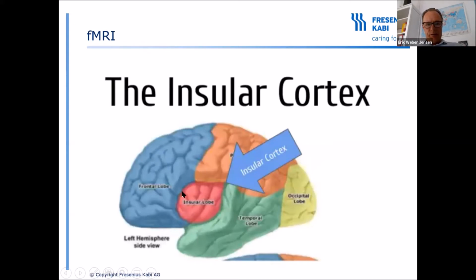Obviously, it would be ideal if we could put the electrodes inside the brain. That's not practical. We will have to put the electrodes on the scalp of the patient and record the data from further away from where we actually have the most interesting or most correlated signal. But with advanced signal processing, it's still possible to extract and separate the EEG from different brain centers.